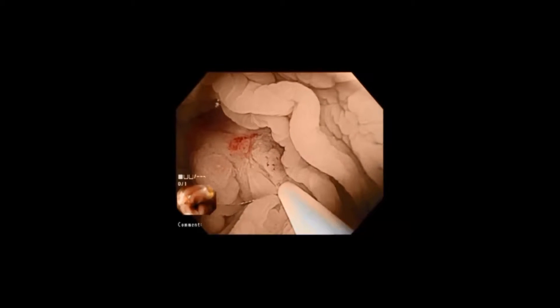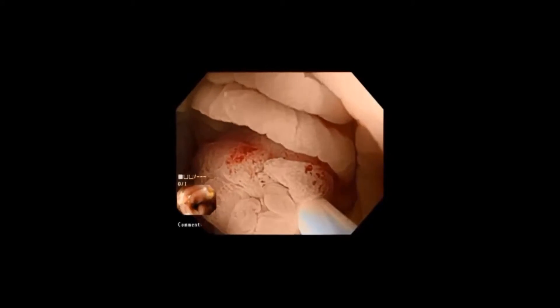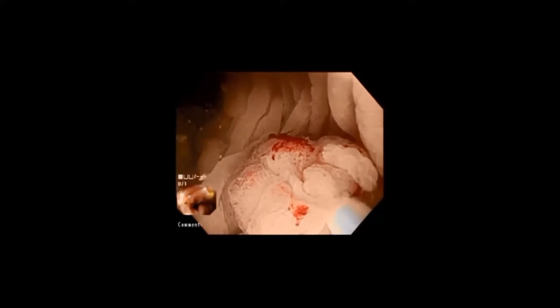Here's about a 15 millimeter lesion in the ascending colon seen with gas insufflation. Then we're going to remove the gas by suction and fill the lumen with water using the water jet, pumping water continuously in order to keep the lumen full. Then we're going to perform EMR without submucosal injection. In this case we're using about a 15 millimeter snare, and you can see we've taken out the polyp and a little rim of mucosa around it.